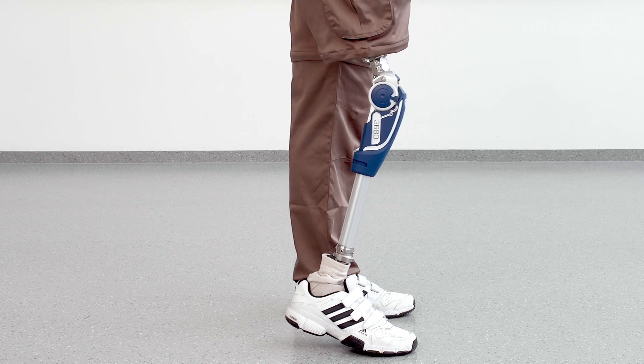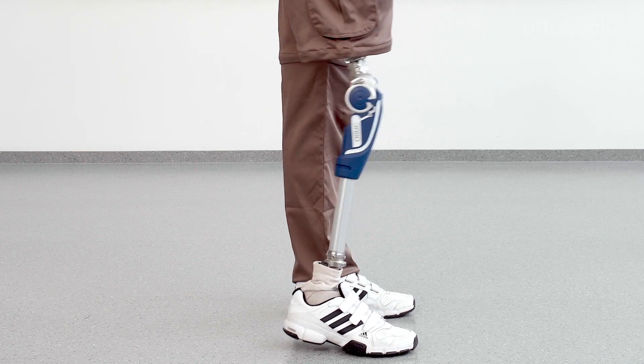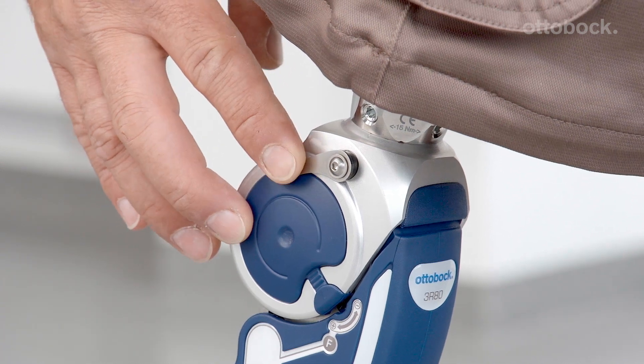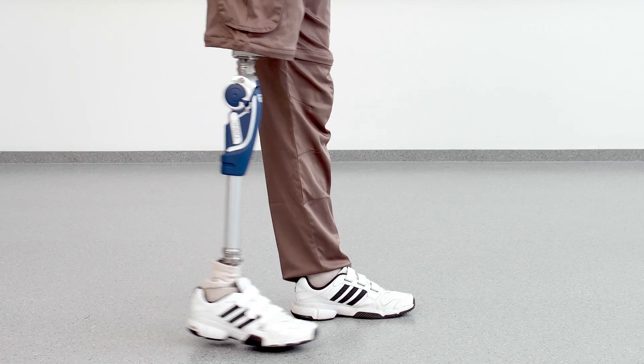To engage the manual lock, the knee must be in full extension with weight through the toe. Once loaded, push the lock lever down and verify that the knee is locked.